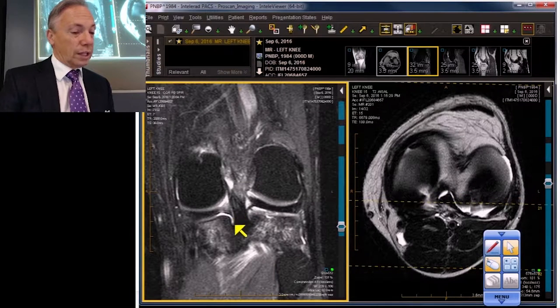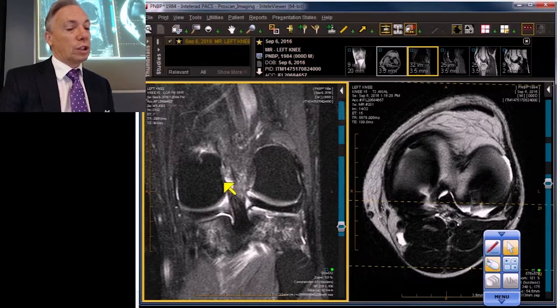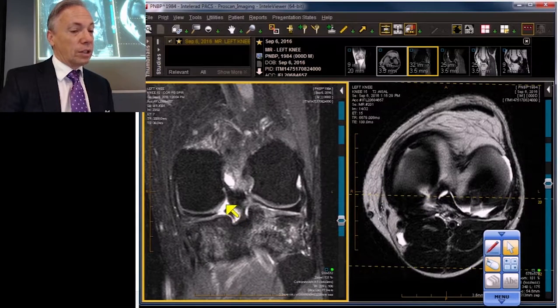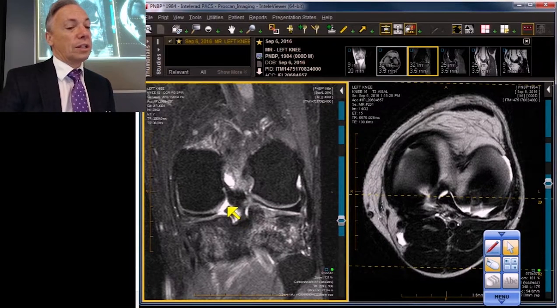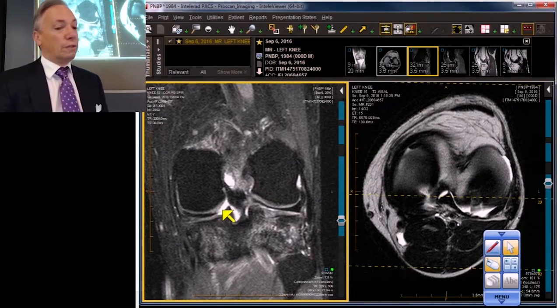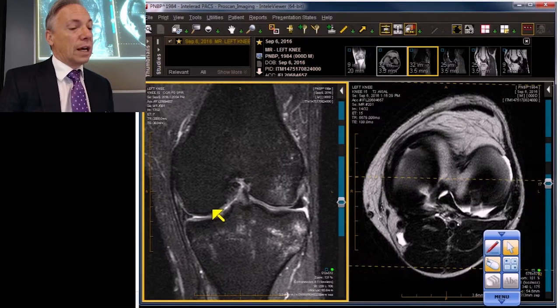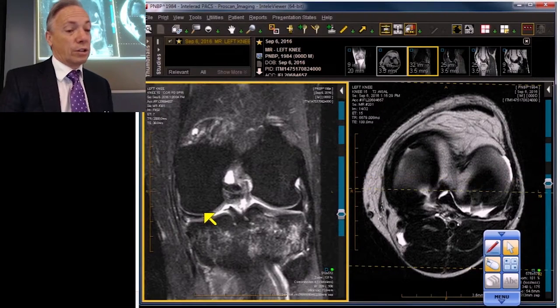There is the root ligament attachment arcing down next to a small bundle of the PCL that courses along the inner wall of the femoral condyle. It's intact, but it is the meniscus immediately adjacent to the menisco-tibial attachment that is torn. So functionally, you've lost your tether there, and that's going to allow over time — with hoop stresses — the meniscus to start to migrate out, though it has not done so yet.